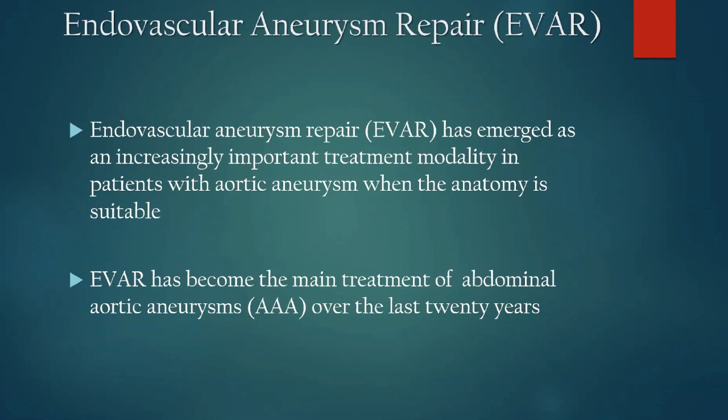Endovascular aneurysm repair has emerged as an increasingly important treatment modality in patients with aortic aneurysm when anatomy is suitable. EVAR has become the main treatment for abdominal aneurysms over the last 20 years. We know it's less invasive and has a faster recovery time.